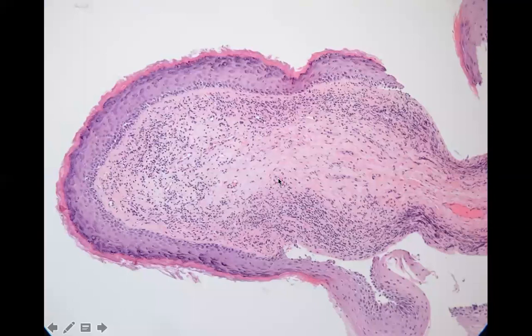So this is an early lesion of lichen sclerosus, and you can see very clearly where your lichenoid band is. This is in the vulvar area, and you can see a little bit of vacuolar alteration, and if you look closely you might see a necrotic keratinocyte or two. That's your interface, and your lichenoid inflammation has moved down just a touch, and here you can see in this zone, this is not the look of normal papillary dermis. It's homogenized.